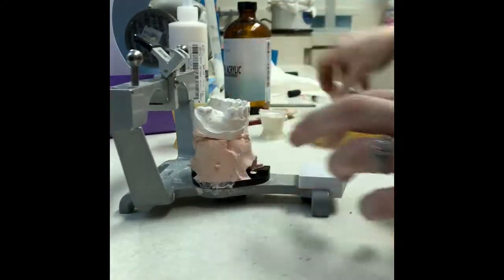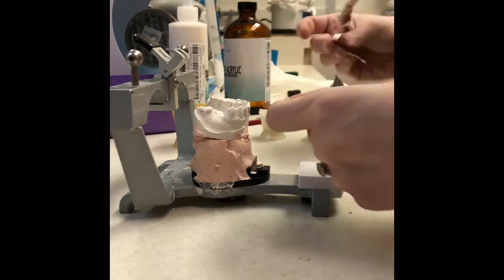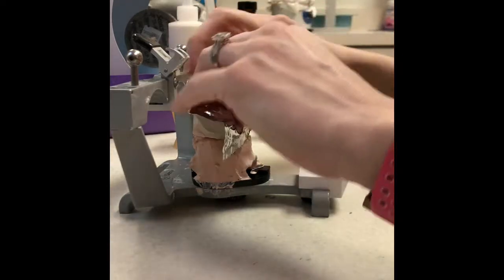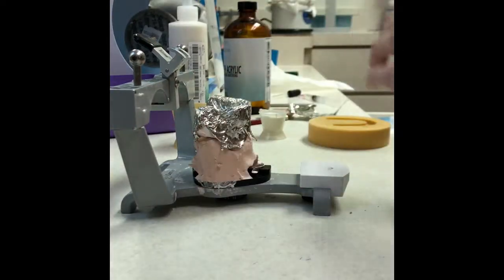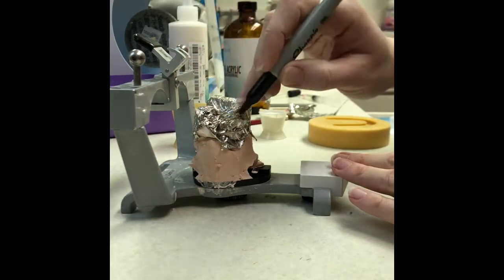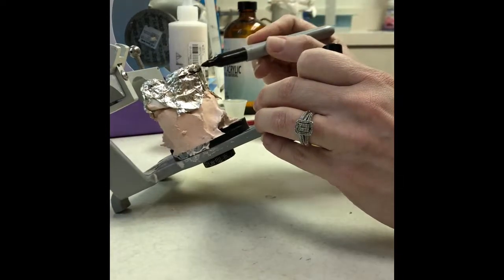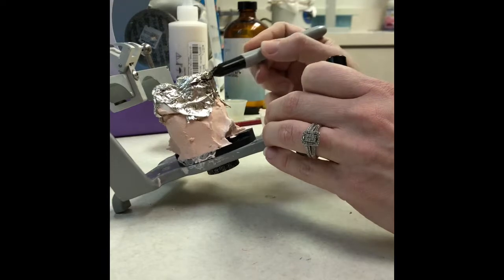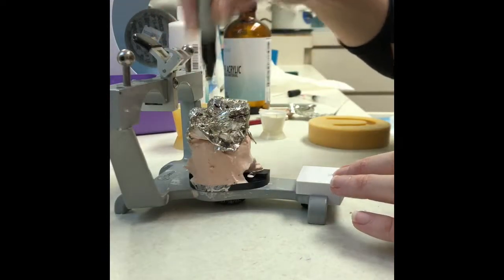On the lower cast it gets the tin foil tightly formed to the teeth. So we put it on here. There's a little toothbrush that we use to kind of form it. Once again, we're going to mark on the foil just exactly how long we want it to be. Always better to have it a little bit longer than shorter. You can always make it shorter. We also just don't want any undercuts to where we can't get it back off the cast.